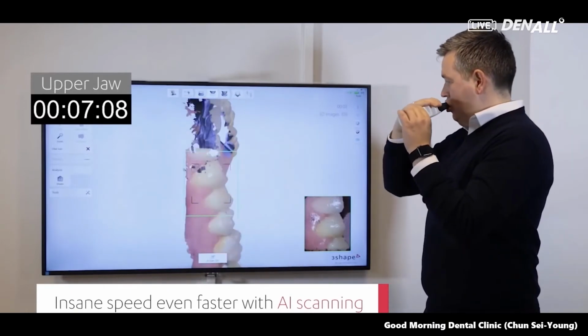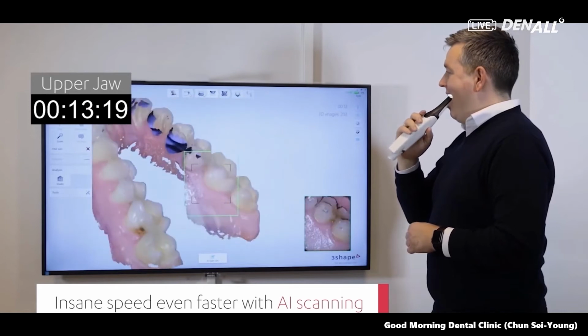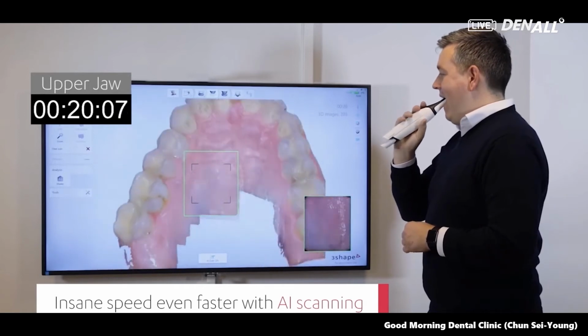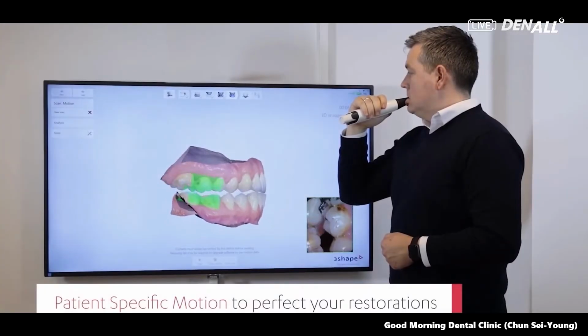Next, as you scan the mouth of a patient, the tongue or buccal mucosa, the unnecessary portions, are captured and that can be removed with an AI function. Only the needed portions can be scanned. Such a function would be very useful.